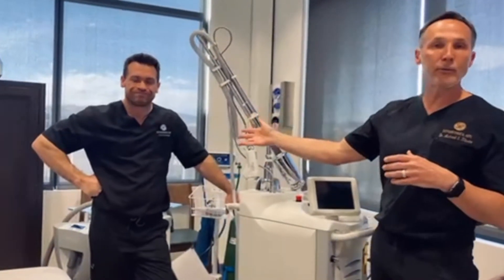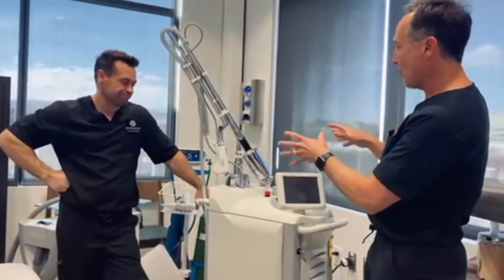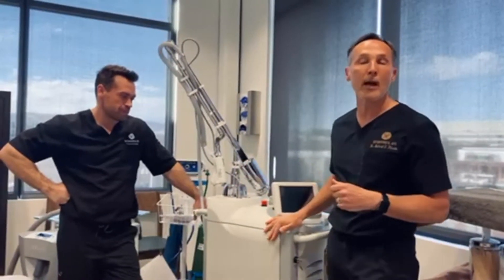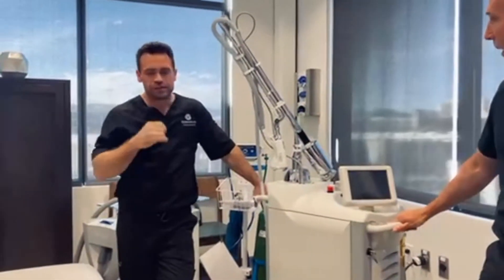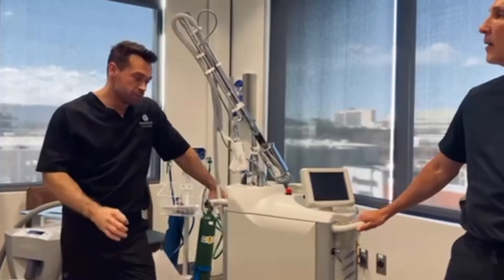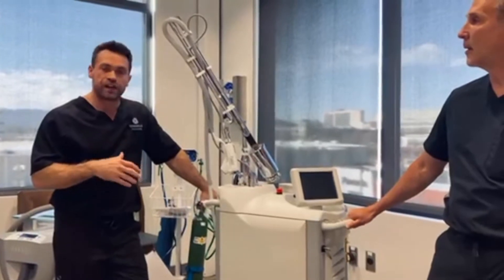With me I have my partner, Dr. Chad Deal, who is an expert in this laser. Myself and some colleagues — brilliant dermatologists, plastic and cosmetic surgeons, and OBGYNs — have all contributed to different facets of this machine.